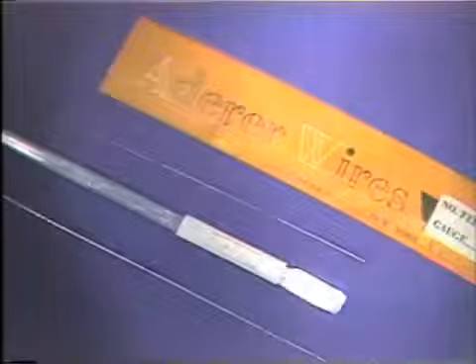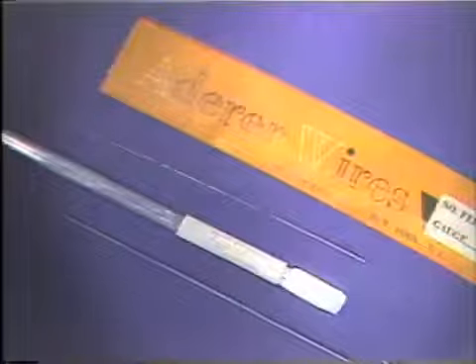Orthodontic wires are most often made of stainless steel, which is a chromium, nickel, and steel alloy. The stainless steel alloy that's used for orthodontic wire has been formulated to provide the most optimal tensile strength, properties of elasticity, and resistance to corrosion in oral fluids that is possible in a steel wire.